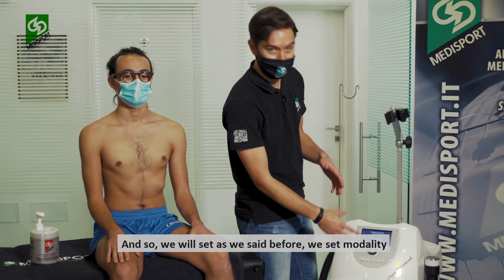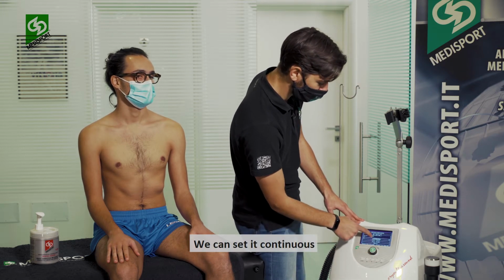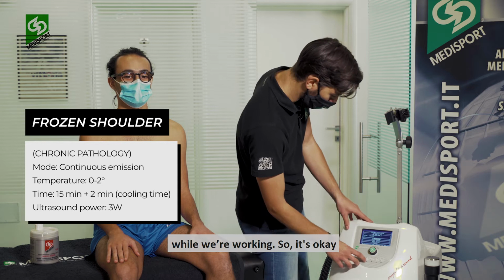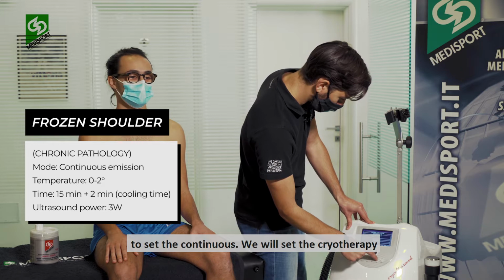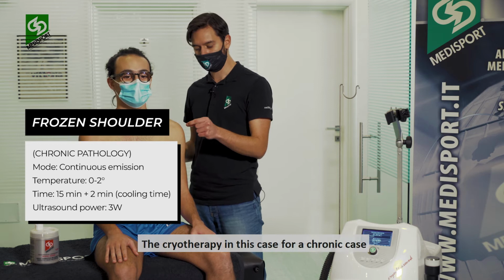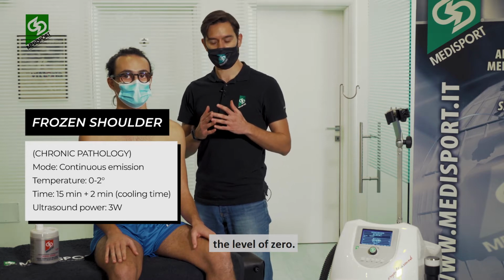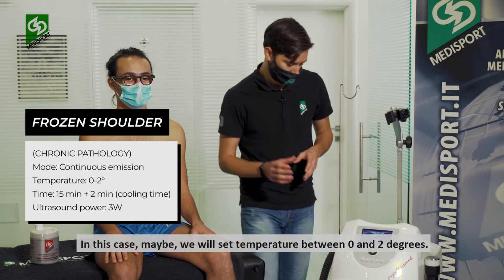And so, as we said before, we set the modality of the ultrasound. We can set it continuous emission, because we want to move the headpiece while we're working. So it's okay to set the continuous. We will set the cryotherapy. As we spoke before, the cryotherapy in this case, for a chronic case, can go from 0 to 2, even below the level of 0. In this case, maybe we will set temperature between 0 and 2 degrees.